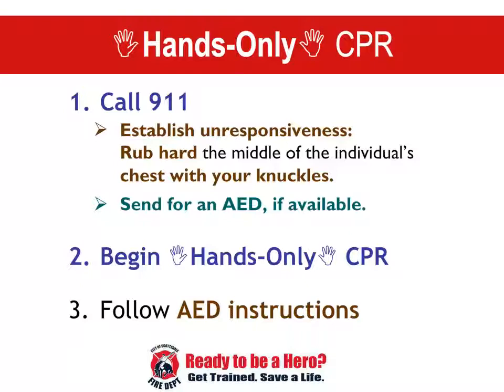Turn on the machine and listen to instructions. The person doing compressions will stop when the AED says, "Analyzing heart rhythm." Do not touch the patient. If it finds a shockable rhythm, it will charge. Ensure that no one is touching the patient. It will shock, pause, then tell you to begin CPR if the patient is not responsive.